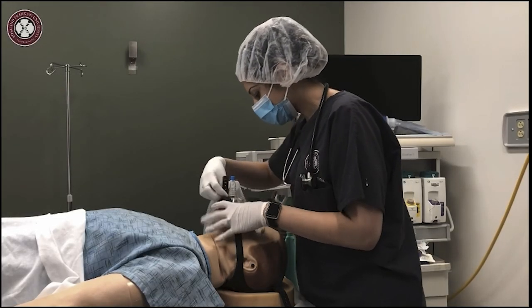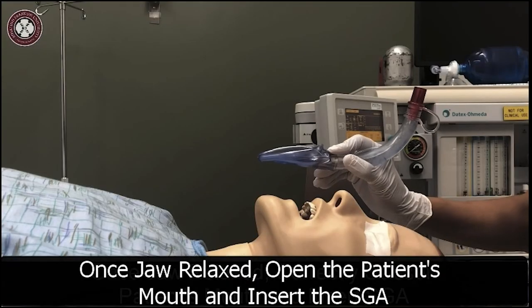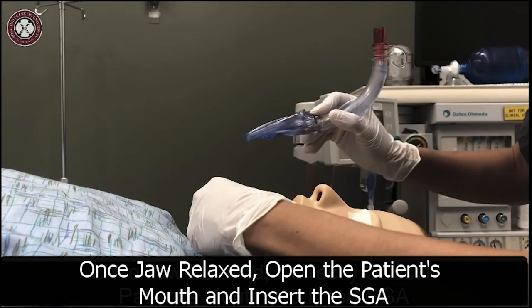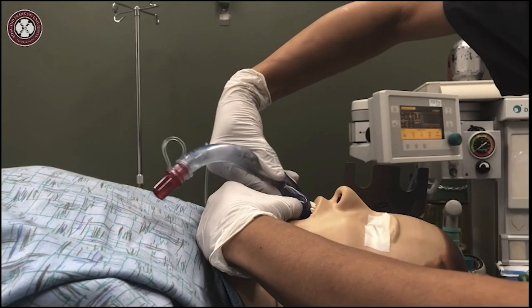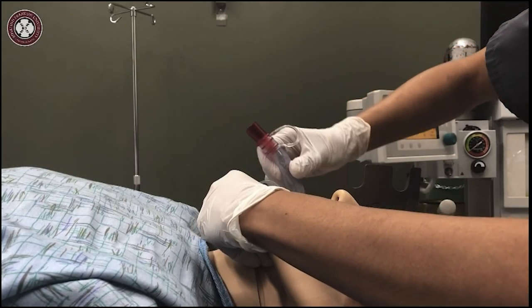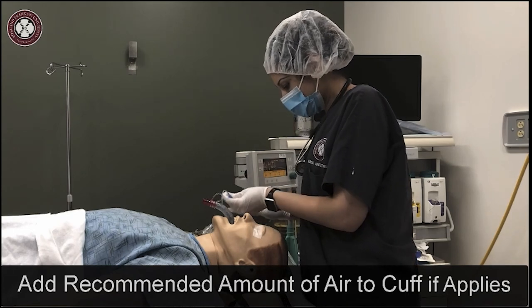The SGA used here is an AirQ LMA. Check manufacturer's recommendations for placement details on all SGAs. When the jaw is relaxed, open the patient's mouth by gently pressing on the mandible, then insert the SGA. Use the index finger to guide the SGA along the hard palate until past the tongue. If the posterior side isn't well lubricated, advancing the SGA will be difficult. Now add the recommended amount of air to the cuff if applicable.